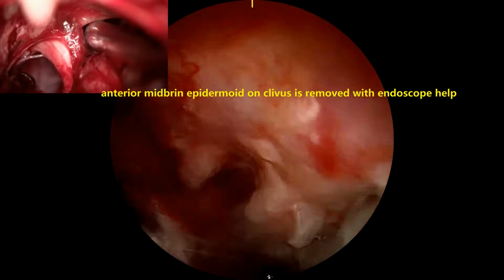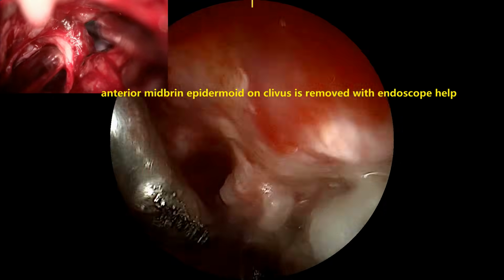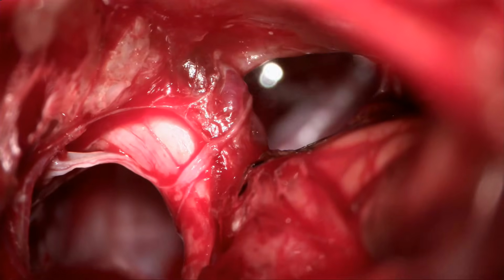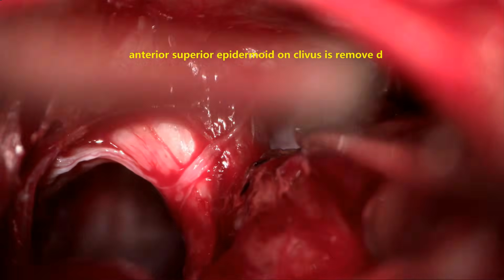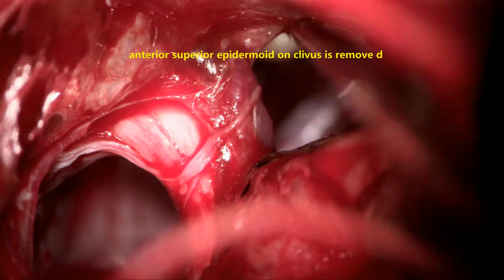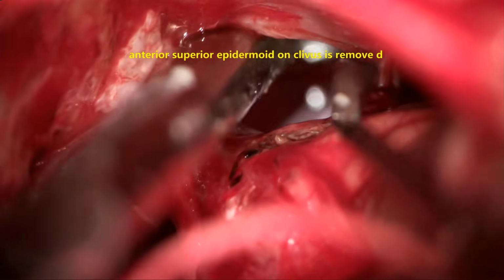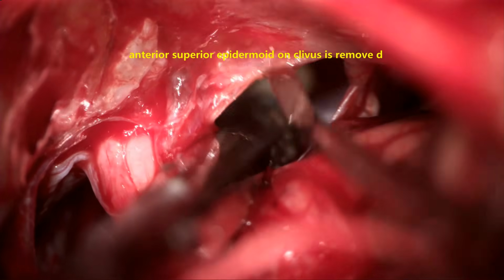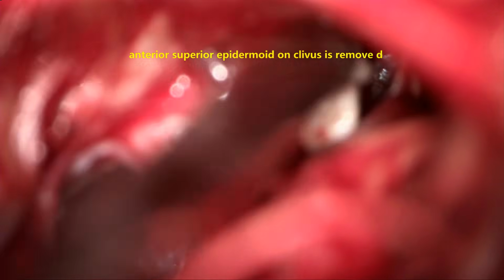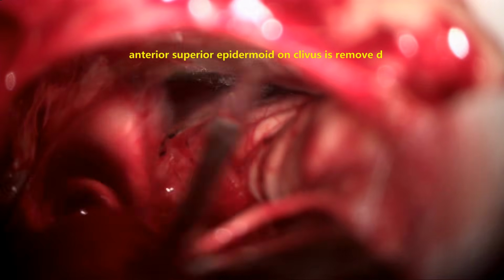You can see the superior part slowly, the bulk of the tumor is coming down significantly. Again, now we locate the lesion there and gently that is dissected. This is the medial temporal, which is going above the tentorium and medial part of the temporal lobe. We can excise it. We don't have to do the temporal craniotomy to access this part.